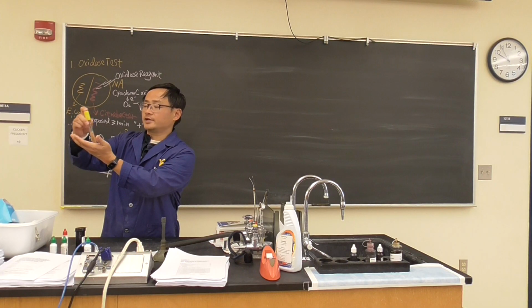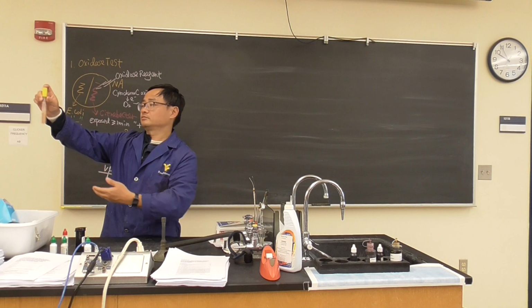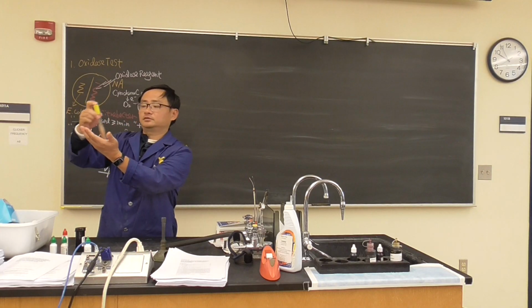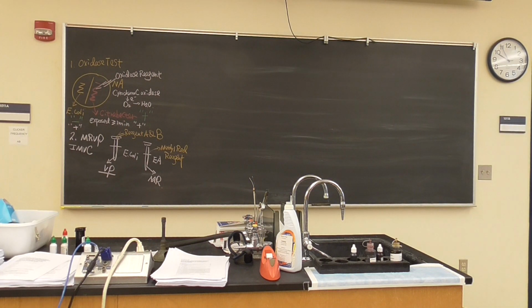If you see it's red, then it's positive. That's not very red, but it starts with red. Okay, just put it on there. We'll let it stay there a little bit, okay?